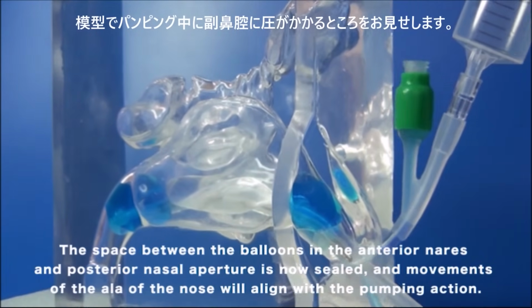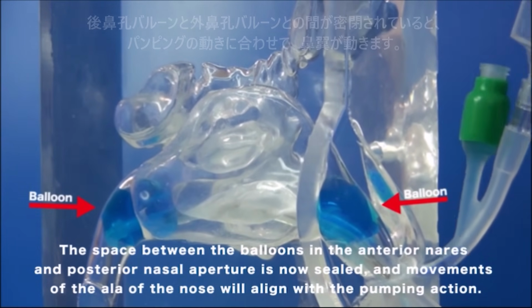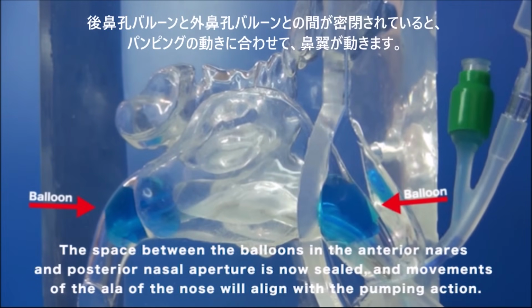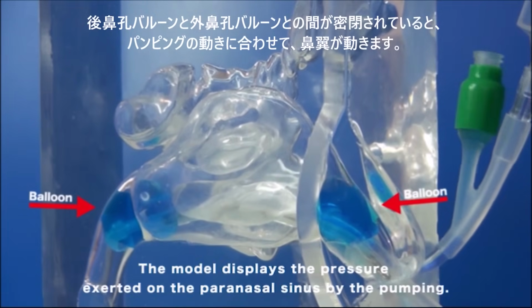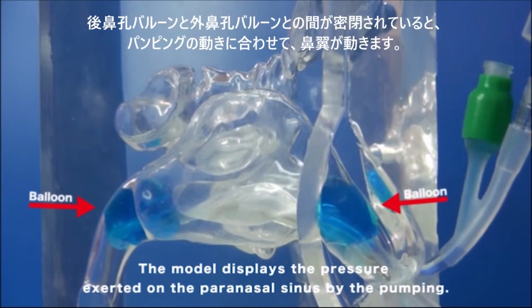The space between the balloons in the anterior nares and posterior nasal aperture is now sealed, and movements of the ala of the nose will align with the pumping action. The model displays the pressure exerted on the paranasal sinus by the pumping.